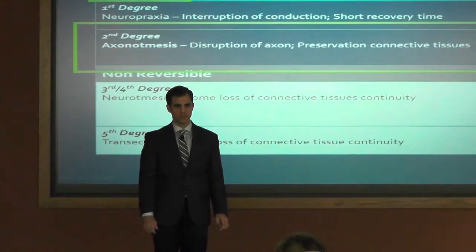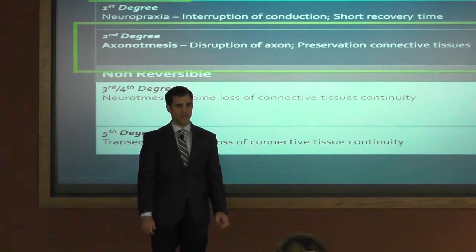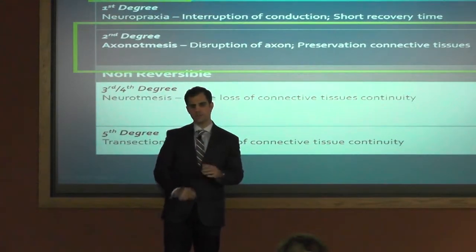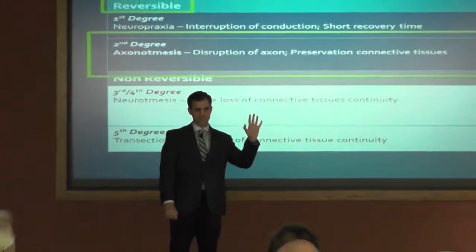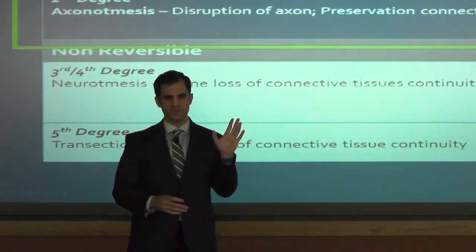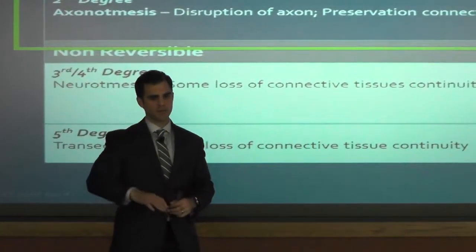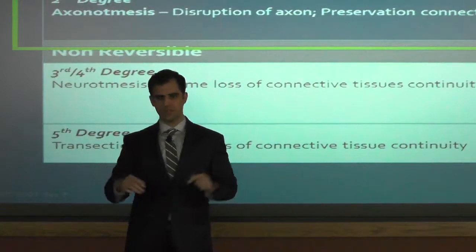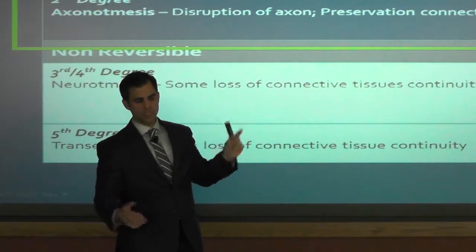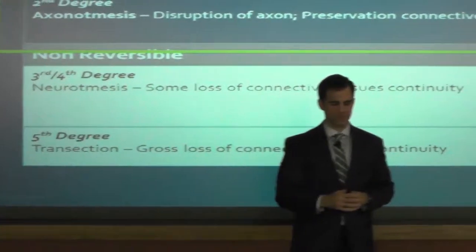What's a repeat cycle? There have been studies, I'll get to some of the studies soon, but I'll tell you a little bit about it. Patients that have arthritis in the knee that got treatment typically get about 3 months of relief, up to 5 to 6 months of relief. Then we did this treatment here at the hospital before surgery, and then they get surgery. That is the same idea, 3 months of relief up to 5 to 6 months of relief.